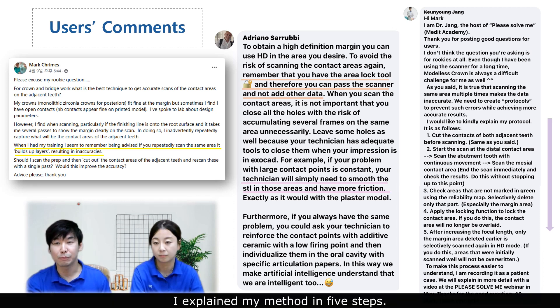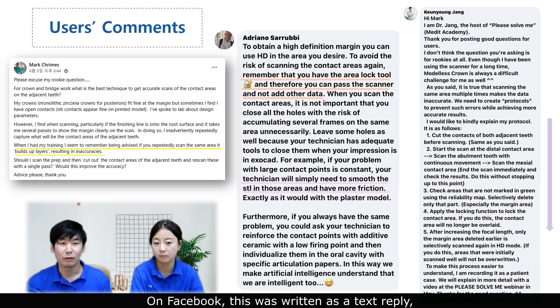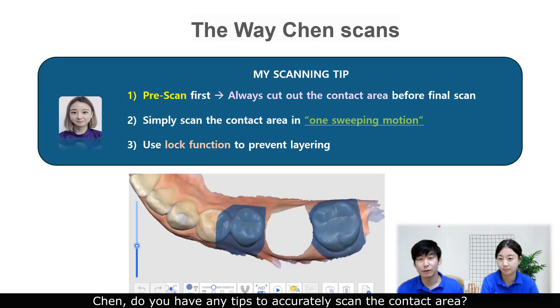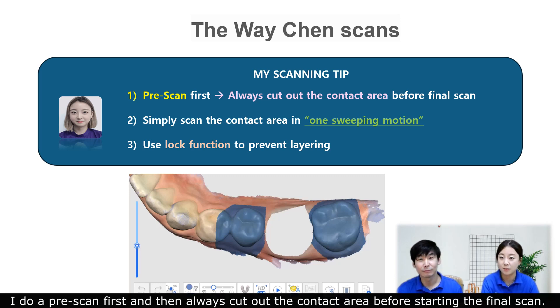I explained my method in five steps. On Facebook, this was written as a text reply, but today I would like to explain it in more detail through pictures and video. Chen's tip: do a full scan first, then always cut out the contact area before starting the final scan. When performing a final scan, simply scan the contact area in one sweeping motion.